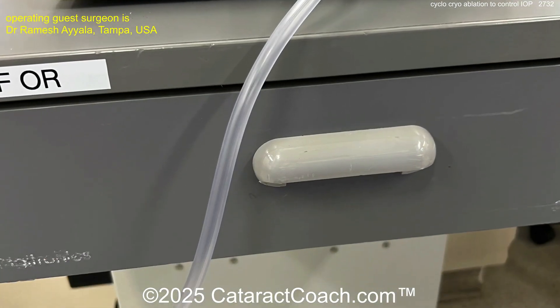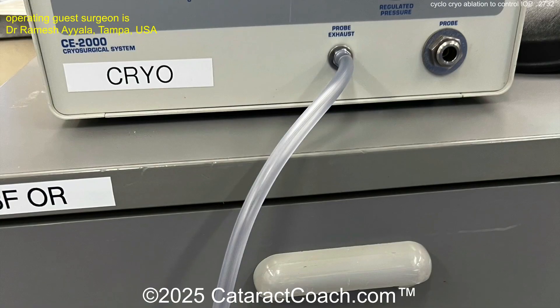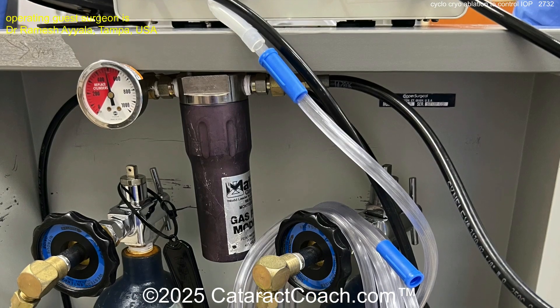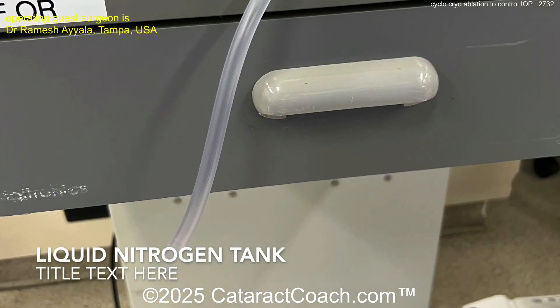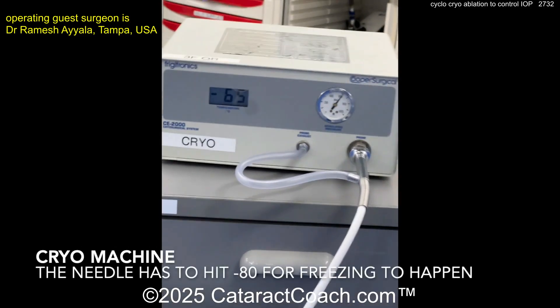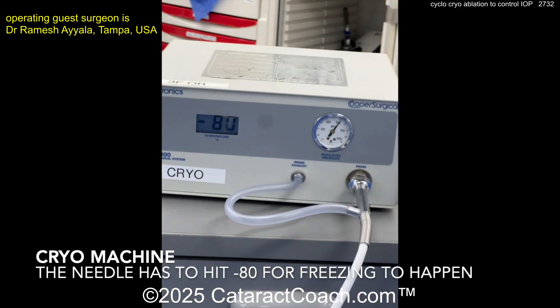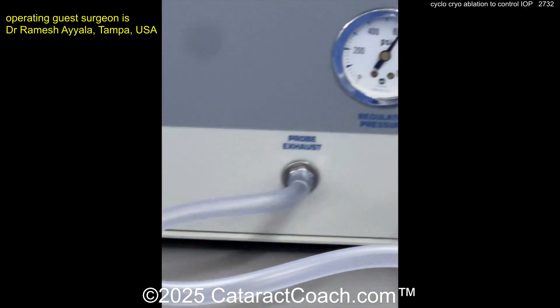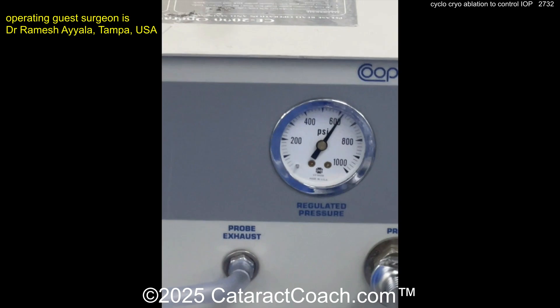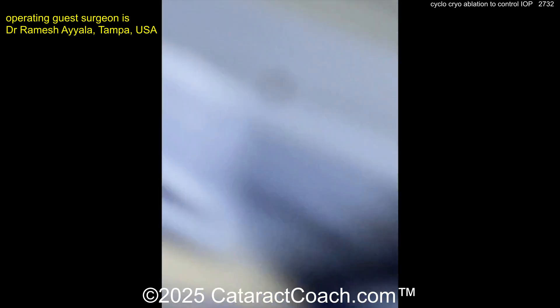Cyclocryo means using the cryoprobe — here it is. The cryoprobe gets very, very cold, and that's going to go transclerally. You can use liquid nitrogen there and get it really cold. That's going to go transclerally and kill off some of the ciliary processes that are making aqueous. Minus 80 degrees is what you're looking for. You can see the regulator pressure going on there.